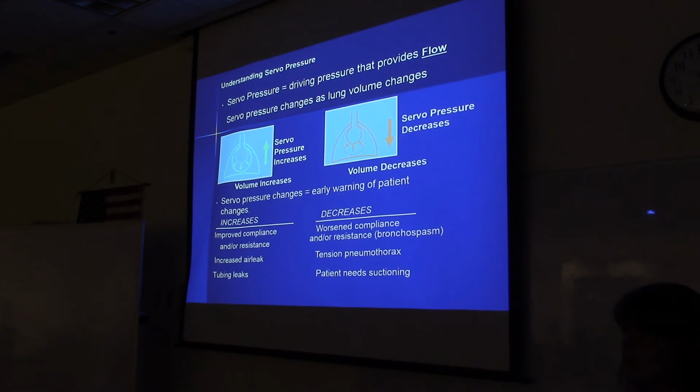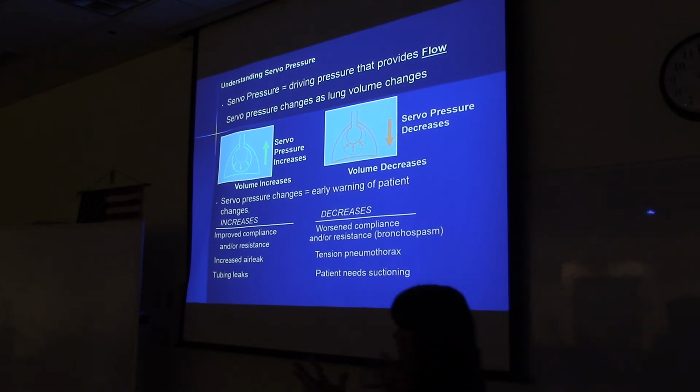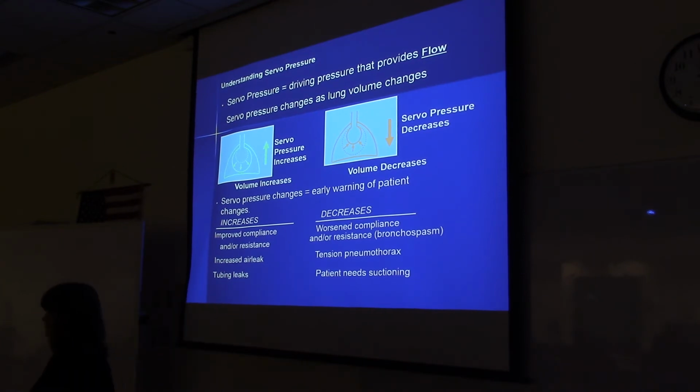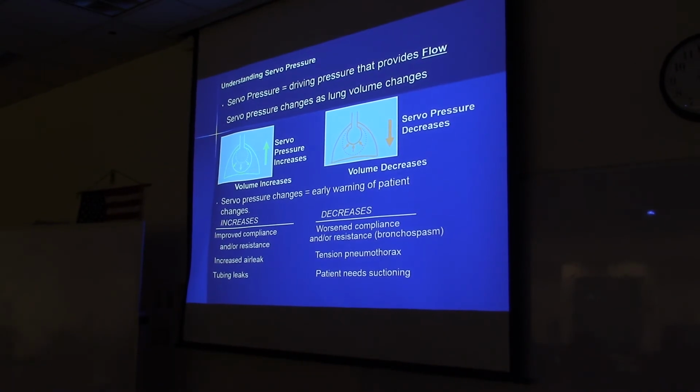All right, so that's servo pressure. Does that make sense? Because that's a big thing with jet ventilation, understanding the servo pressures. Danielle, do you have anything to add to it, to help clarify it?